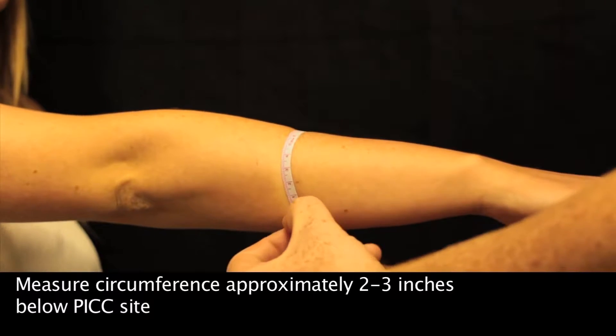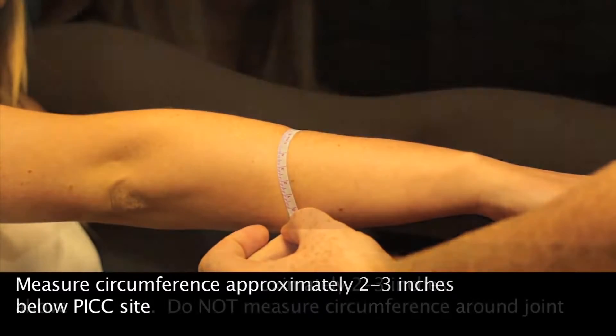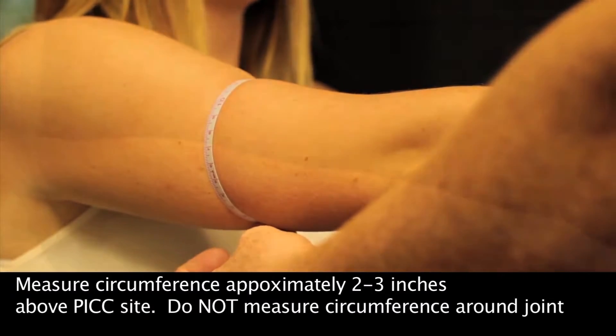Begin by measuring the circumference around your arm about two to three inches below the pick site. Then measure the circumference about two to three inches above the pick site, making sure to not measure the circumference around the joint.